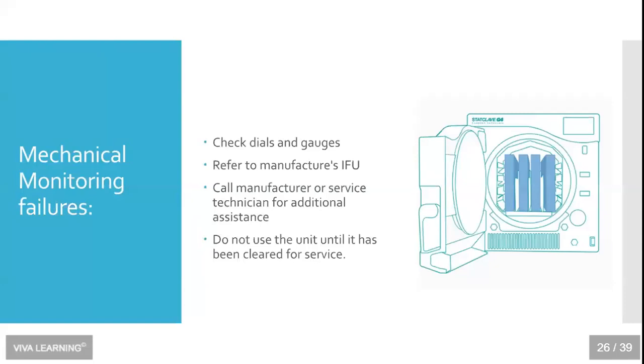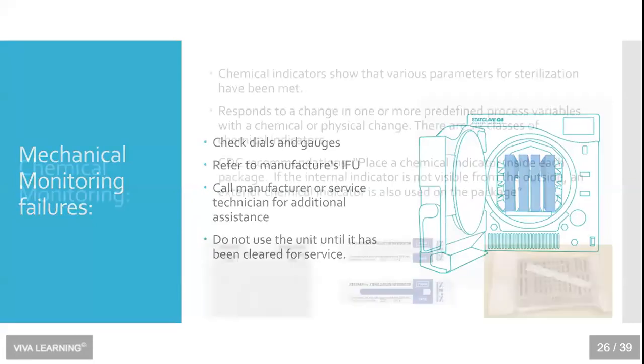And if you're not getting anywhere with the instructions for use, don't hesitate to call the manufacturer or the service technician for further assistance. And don't use the unit or the autoclave until it's been cleared for service, until you are sure that it is indeed performing correctly.